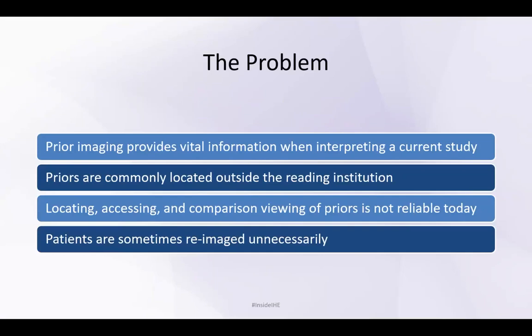So the initial imaging is done remotely, a problem is found, the patient comes to the cancer center, and on the subsequent studies, the radiologist will have to compare with previous to report on lesion change, if they change in size and appearance, but also if there has been interval development or resolution of other conditions such as metastatic disease, peritoneal seeding, or pleural effusion, and sometimes not easy to see because it may be very tiny changes or tiny lesions.